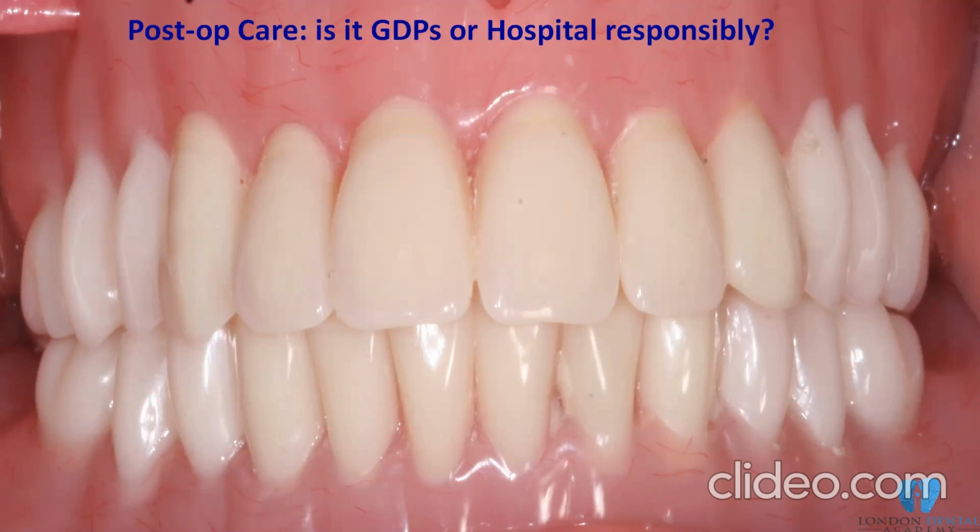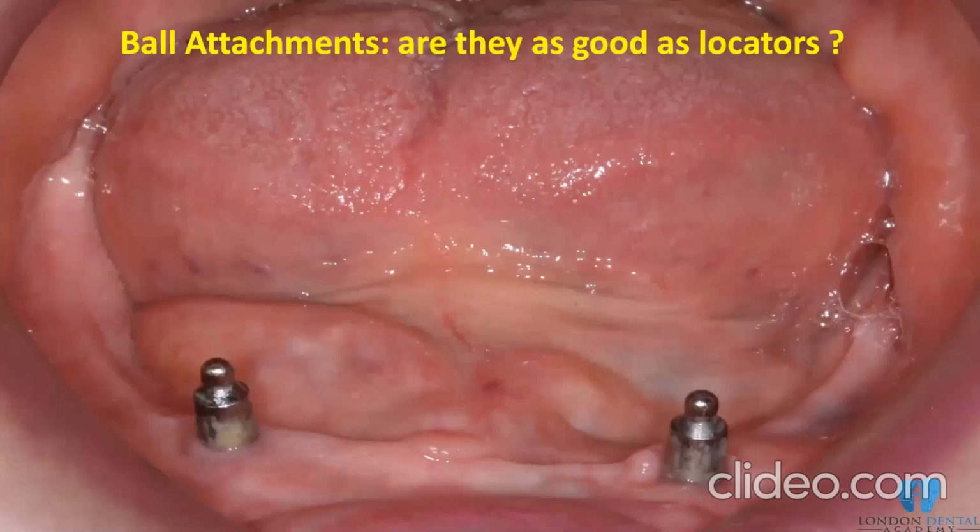And the teeth, don't get cheap teeth, please. Invest in the teeth, they're not that expensive. Some companies like Predent do very nice HPP, high performance polymers. Use the nice teeth, and that is an investment for you. Then you don't want them to wear down quickly. You want them very aesthetically nice. You will see some cases in the webinar.